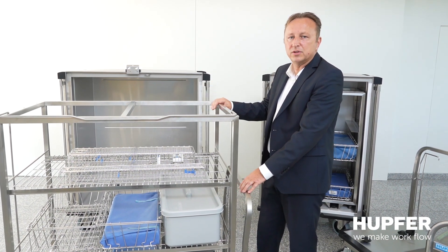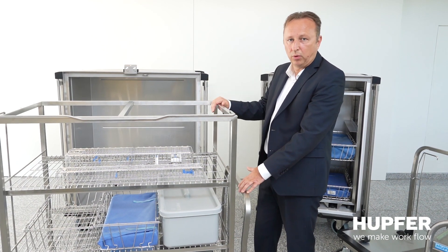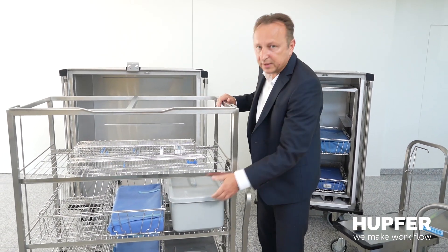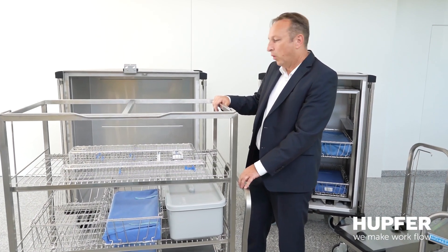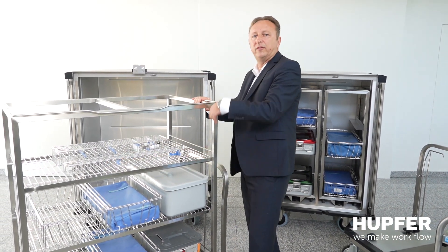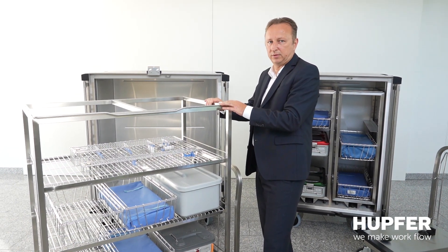There are a few issues we need to clarify: What should be transported? How big is the item? Is it an STU basket like this, or a pre- or ISO basket that you need to transport, or any other size? Here you can see, for example, you can even have wire shelves, providing much bigger space for longer instrument sets that you need to transport.